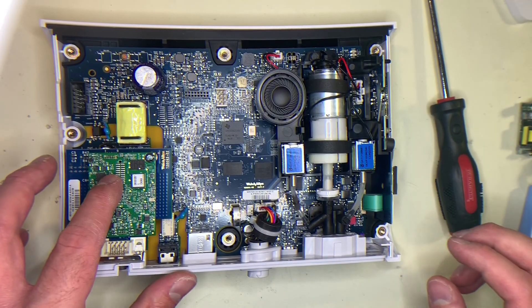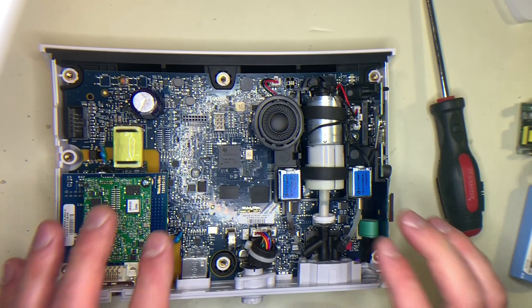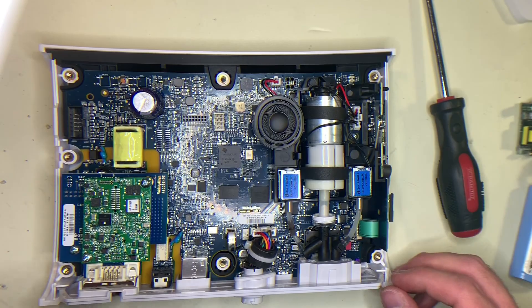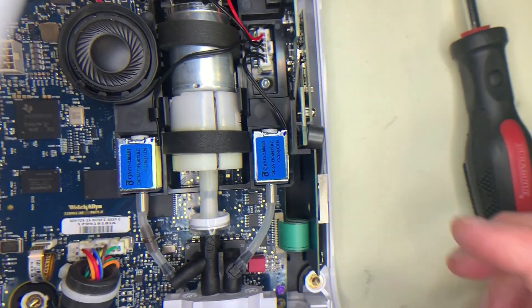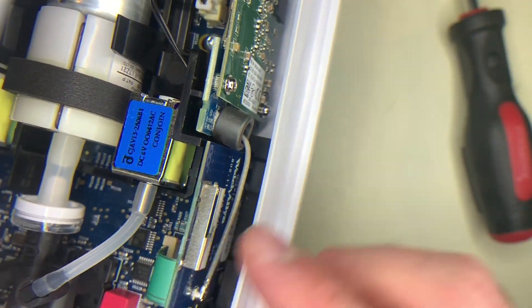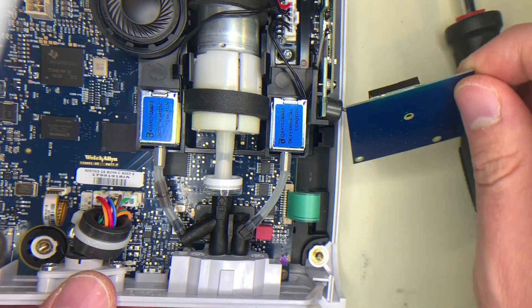Before we can remove these boards, we first need to remove this plastic bottom part here. But in order to do that, we have to remove the entire main board from this device. To do that, it's actually not that difficult. You will need to come down here where you have the wireless adapter and the antenna. You can just pull the wireless antenna up a little bit and move it out of the way.